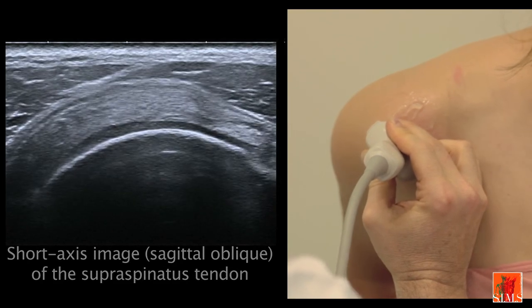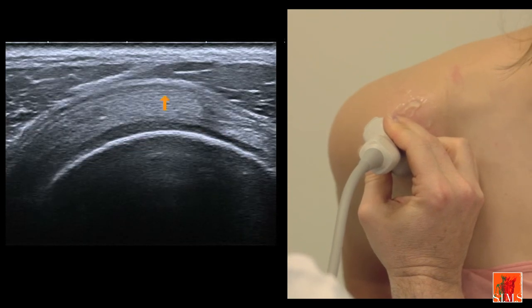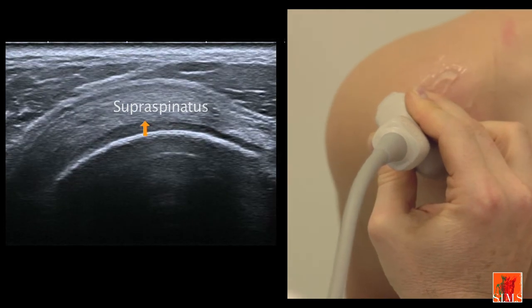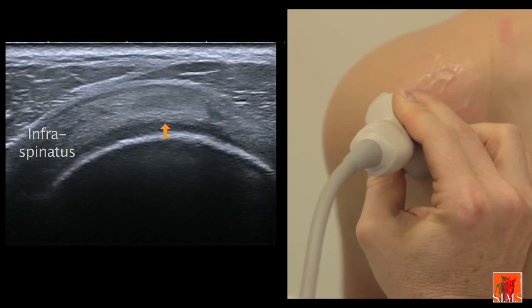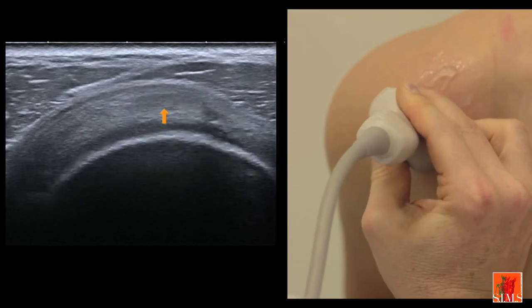The biceps tendon is positioned on this side of the screen, and this part that you see here corresponds to the supraspinatus. The first 15 to 20 millimeters correspond to the supraspinatus. More posteriorly, we will re-encounter the infraspinatus. In favourable cases, we can attempt to see the anterior bundle by using anisotropy, which is what we are doing here.